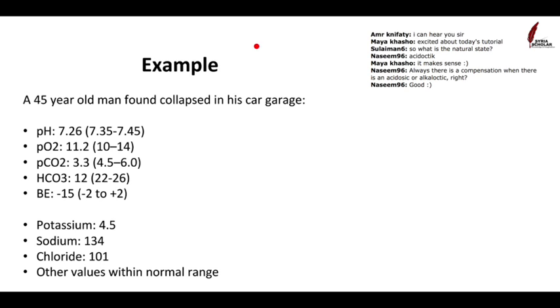Okay, so this is a 45-year-old man who has been found collapsed in his car garage. So we'll work through our system. Here's the pH. Is it acidotic or alkalotic?